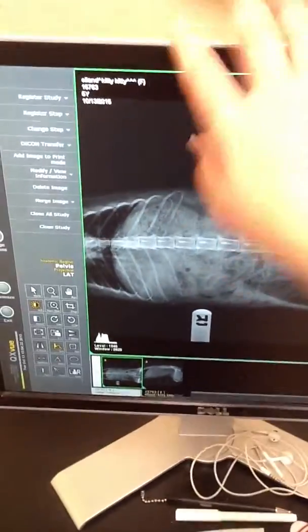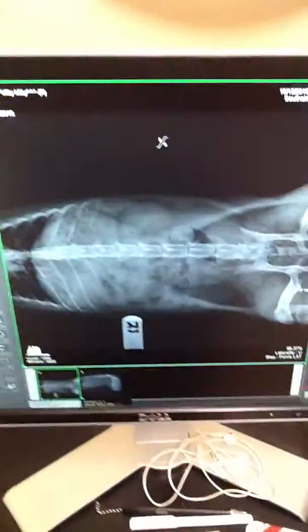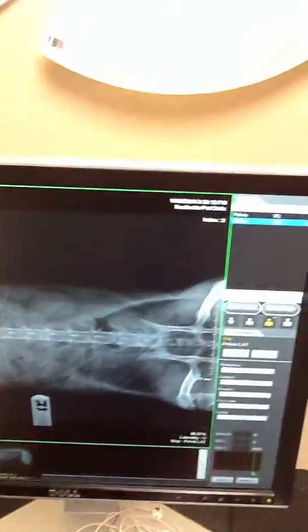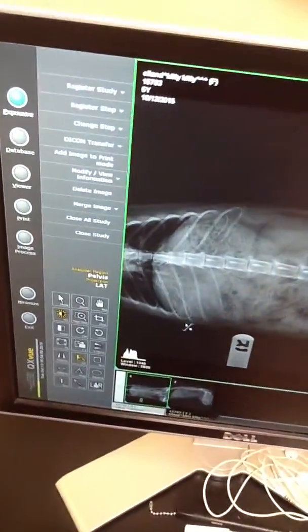And then once you would shoot your x-ray, that is our pedal that you would shoot with. It would go over here to the machine, and it shows you on our system the name is Kitty Kitty, Island is the last name of the animal, it's a female marked, the patient number, how old the patient is, and the date. And then it also has the views down here. There's another view if this were our animal. And you transfer these right here, a transfer, and you would transfer all images, and it would go to every computer in our clinic so the doctor could open up the x-rays anywhere they would like.